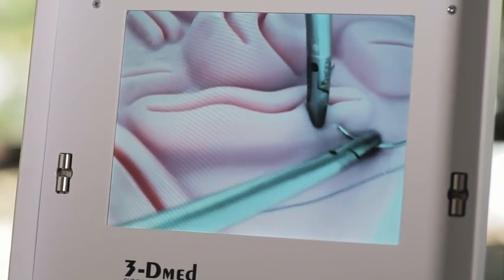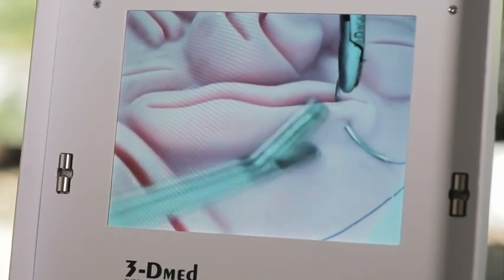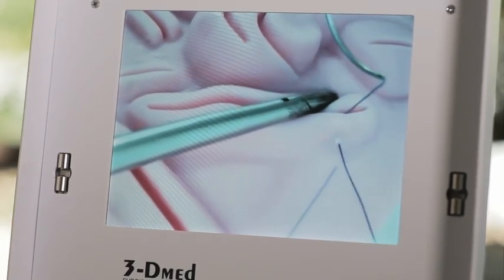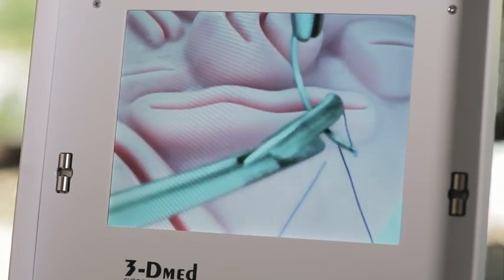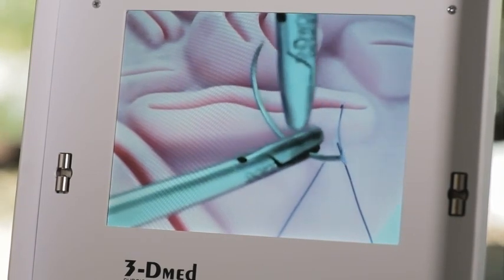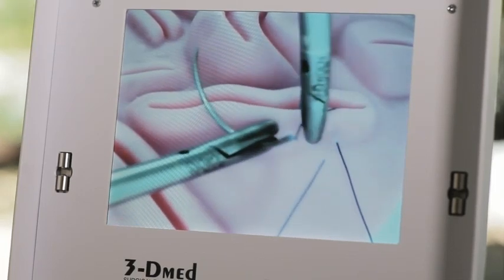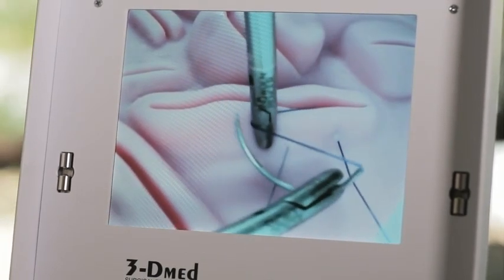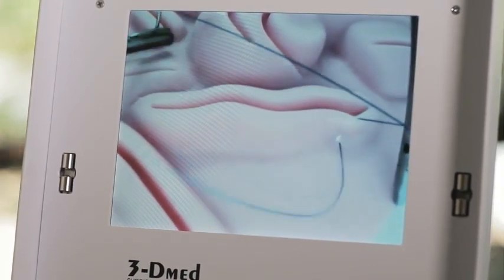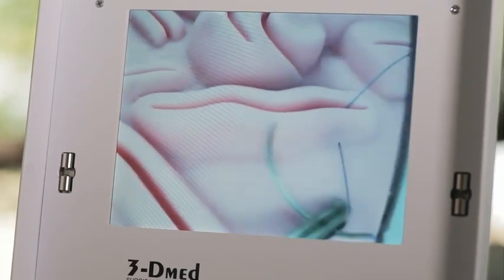I'll pass the needle all the way through and without changing the orientation my grasper will lift it. I'll hold the tissue with my needle driver and pull it through. For maximum efficiency I'll re-grab the needle in the exact sweet spot which is about two-thirds of the way from the tip to the hub.